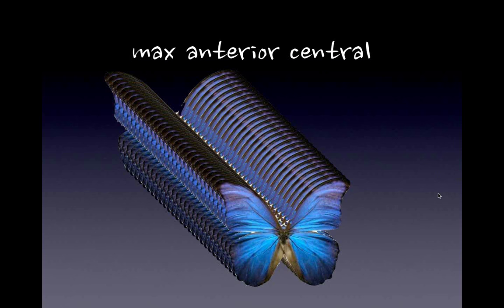Do you make your own tabs with composite that you have? Yes, I do. That's the whole thing, is to get your composite, whatever you're using, so you have your own specific tabs. How do you determine the thickness of pearl frost? I think it's touch and feel. You've got to put a little bit of it. I think it's never more than a half a millimeter. It's always very, very slight.